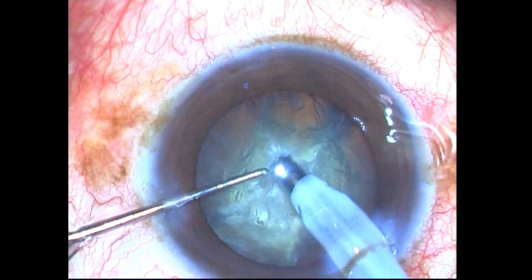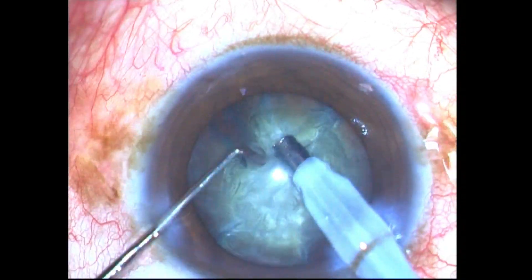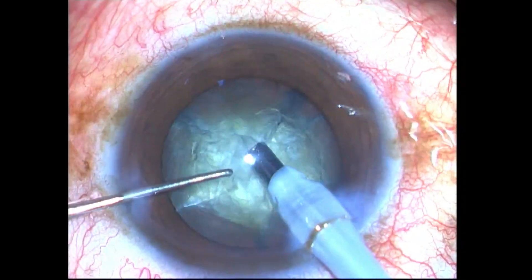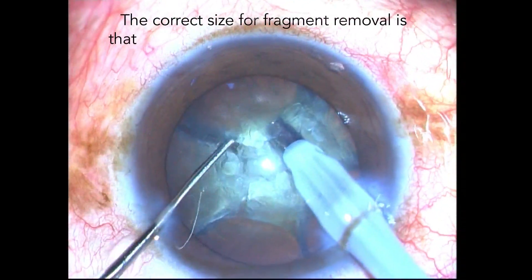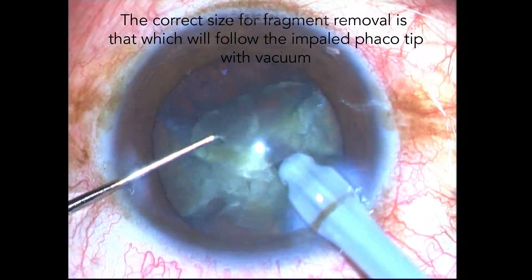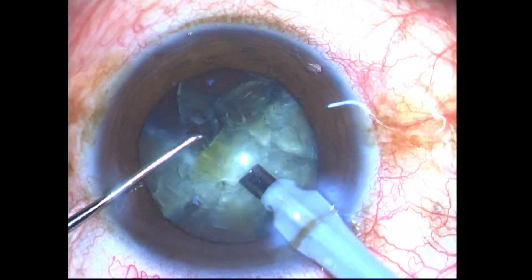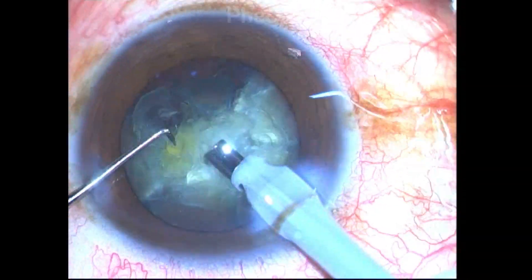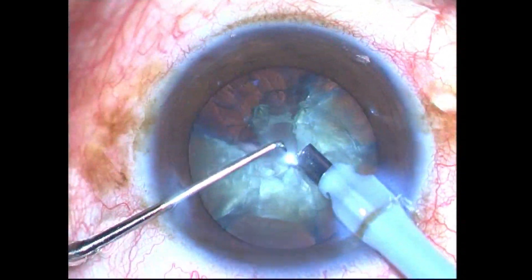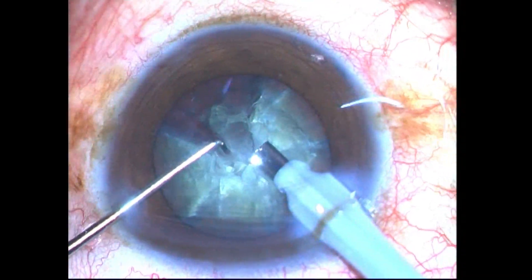Stay within the central zone and create as many fragments as possible. You know the fragments are ready for mobilization if they follow your facotip after getting impaled with vacuum into the safe zone for emulsification. If this does not happen, you need to create smaller fragments until this phenomenon occurs.